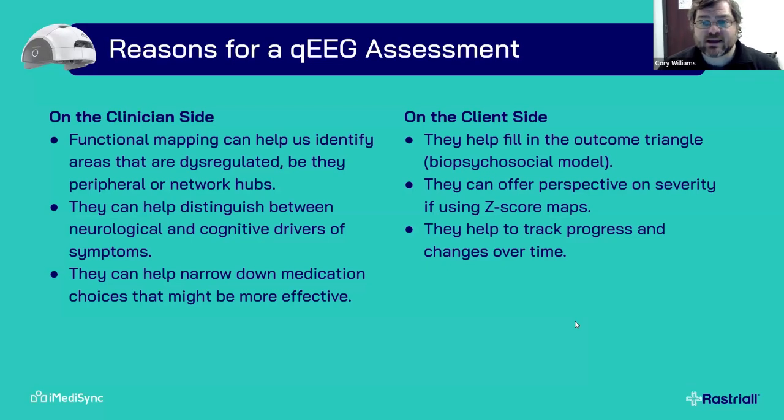Well, one is that it helps them to understand the role of biology and how they feel, right? If we think about things from a biopsychosocial model, this is a way to visualize what the biology looks like. It can offer some perspective on severity by comparing to a normative database. We can tell a client, this activity is 3 standard deviations outside the norm. That's a lot. Or actually, this is pretty close to normative, so it's not a thing to worry about.